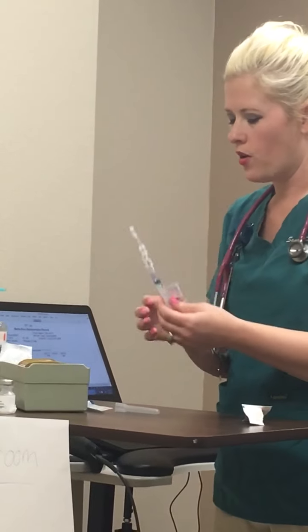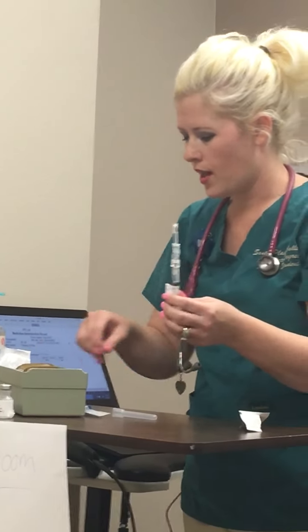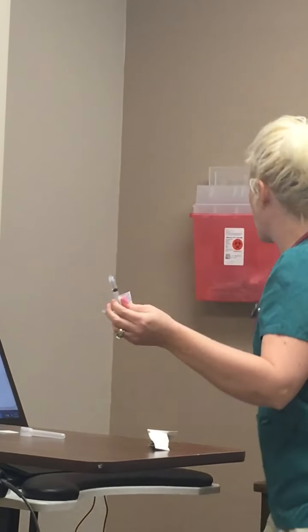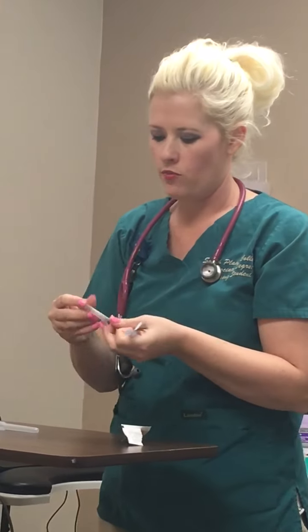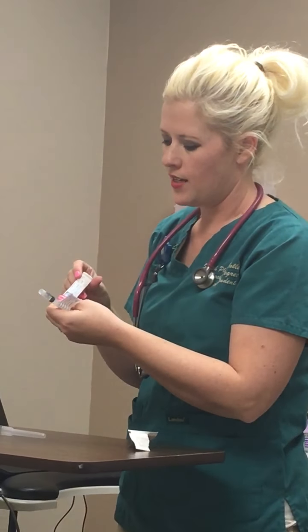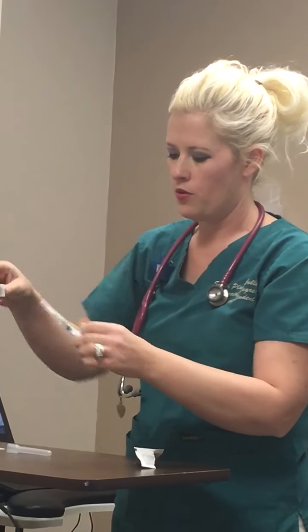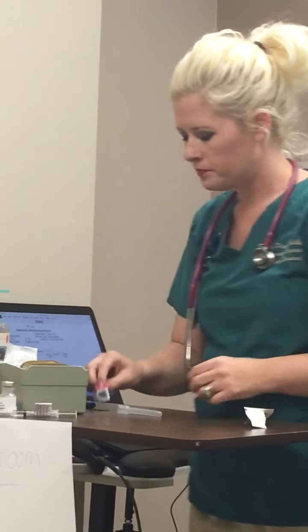At this time, I'm going to go ahead and change my needle, knowing that I cannot give an injection with the same needle that I drew up. So I'm going to go ahead and take this needle off. I'm going to go straight to the sharps. I'm going to lift the package of my new needle, making sure it is in date and not expired and not open. I'm going to place this onto my needle, and I'm ready to go.